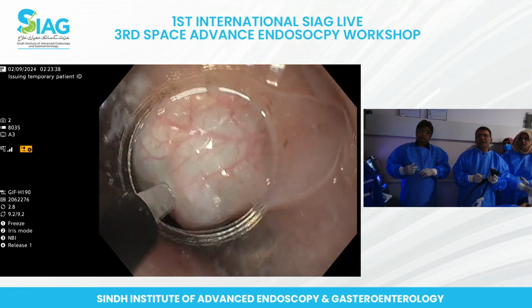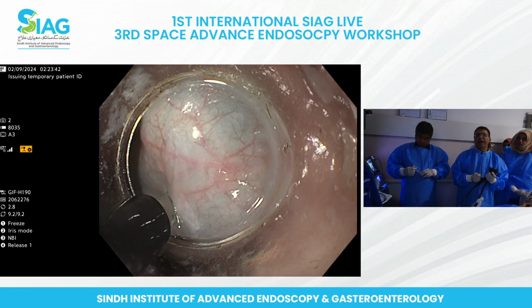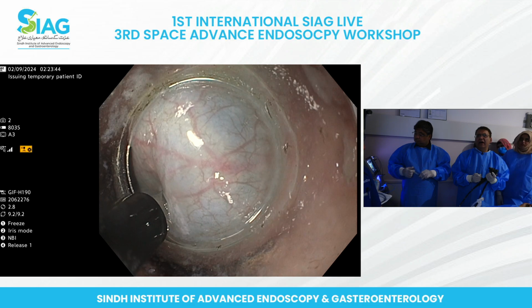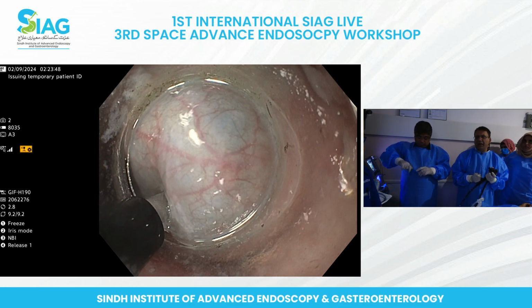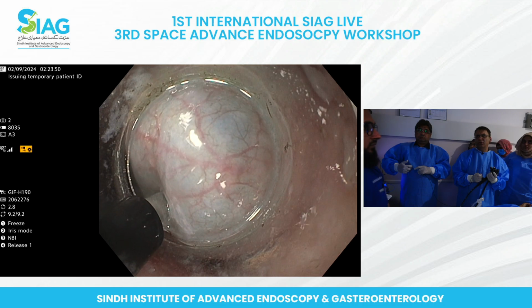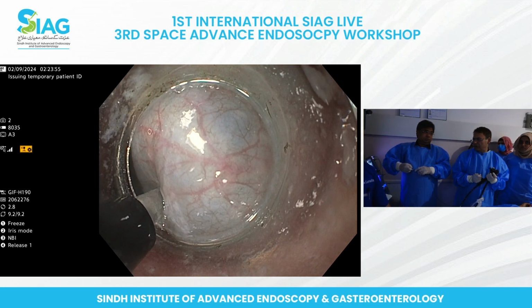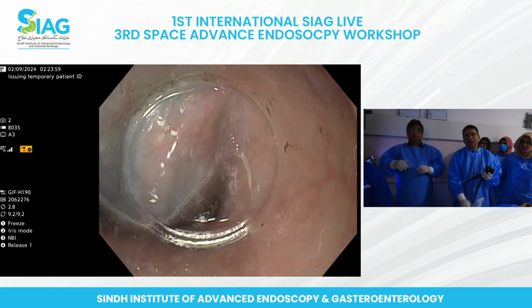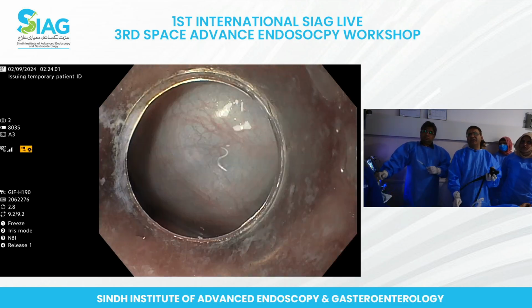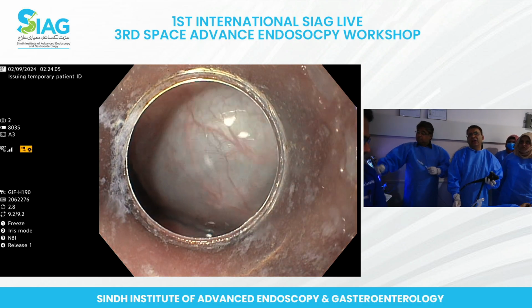So what I'll do is I will do a really good injection here because this is the entry point. I don't want to do a muscle trauma or muscle injury right at the entry site. So I'll do like 3, 4, sometimes 5, 6, 10 ml, whichever. That's good enough. Leave it. Needle out of the patient. So you see that's a nice lift there, nice injection there. And I think this is a good injection.